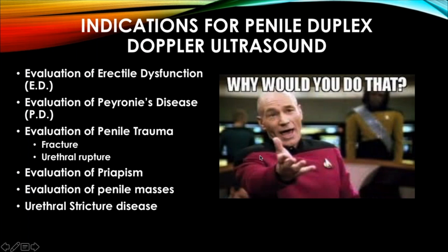So what are the indications for penile duplex Doppler ultrasound? Why would you do that? On the left are pretty much most of the current indications. It's indicated for the evaluation of erectile dysfunction, and we'll go over exactly what areas are suggested for that.